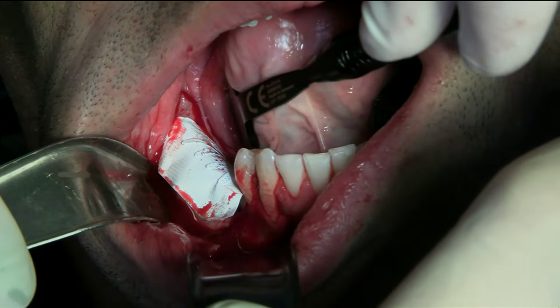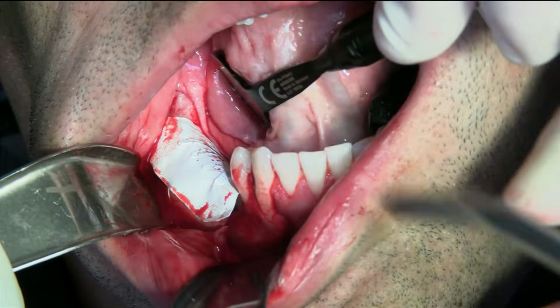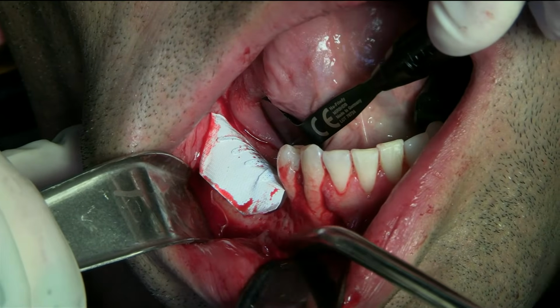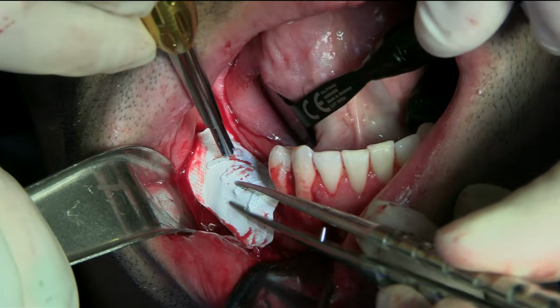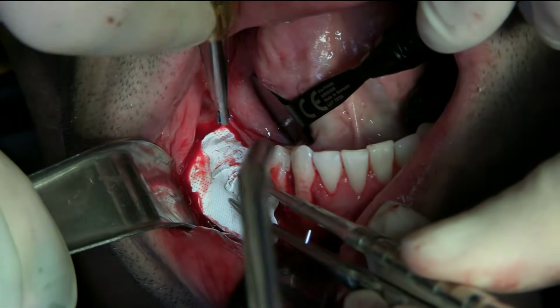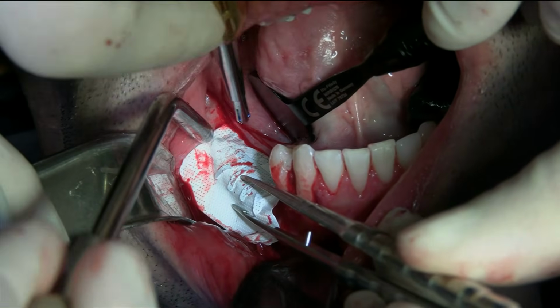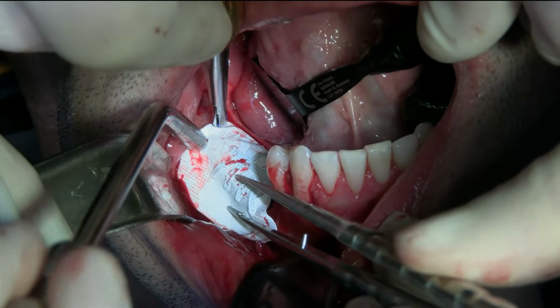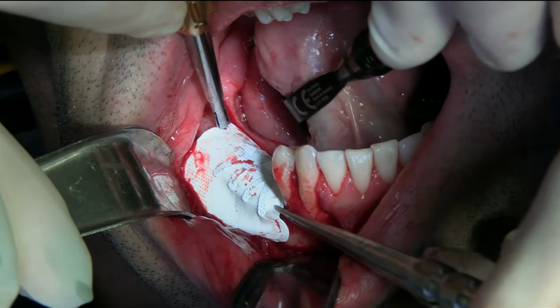Okay, hold this. Yeah, hold both. Be careful again with the mental foramen. So touch me. Let's see how that's on the mesio.